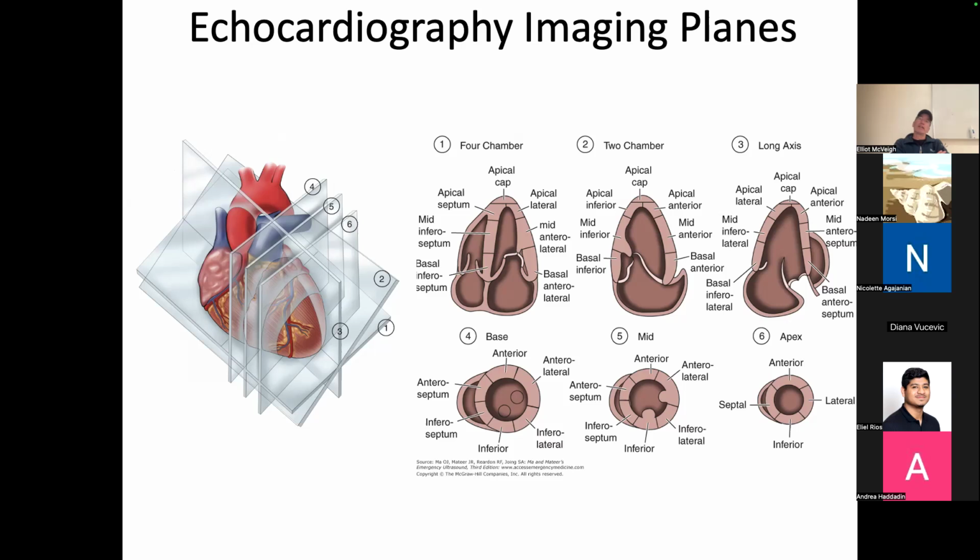This resolution is fine for that type of clinical report, and it comes out of, I think, nuclear medicine, because this is actually the spatial resolution of nuclear medicine imaging. The signal comes in big chunks like this. It's low resolution. With CT and MRI, you get much higher resolution. So usually you'll take this as the basic mapping, but inside that you can do subdivisions, right?